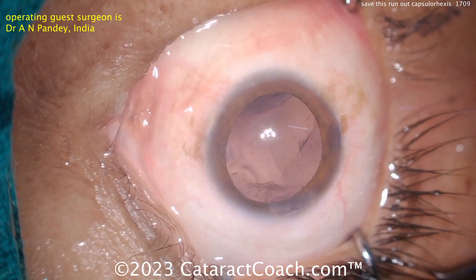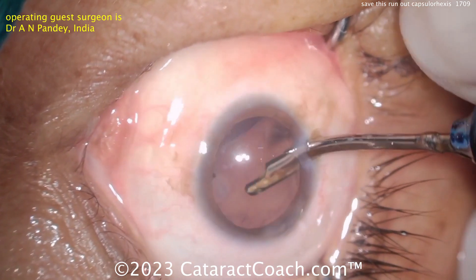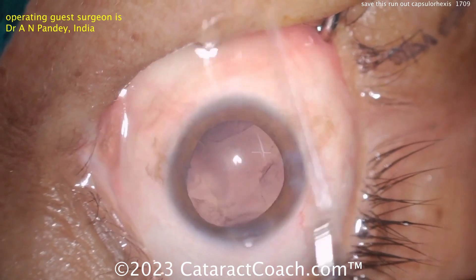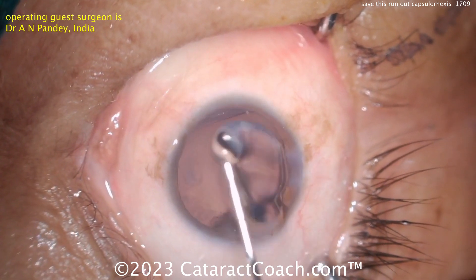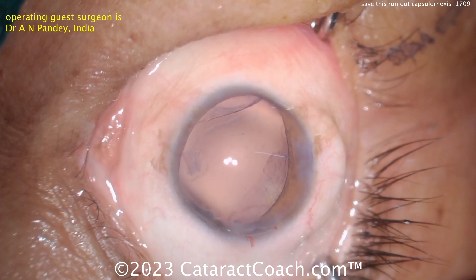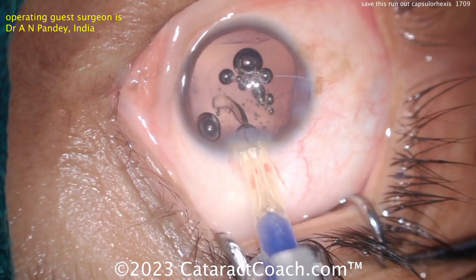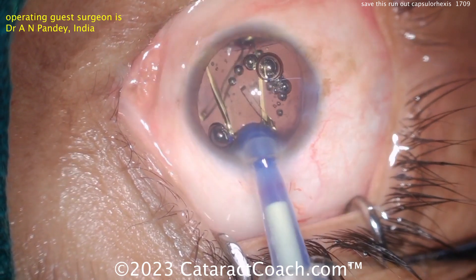Let's get that lens in. Things can still go south — you can't assume you're okay at this point. Be very cautious filling the bag with viscoelastic. Fortunately, it looks like that rexis run-out area is holding up pretty nicely.